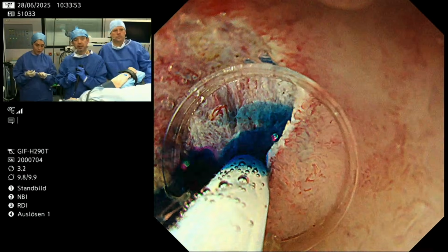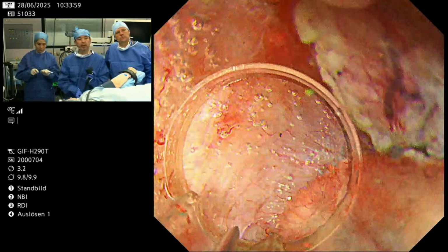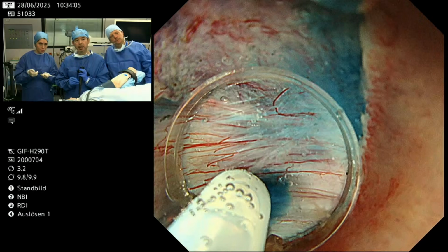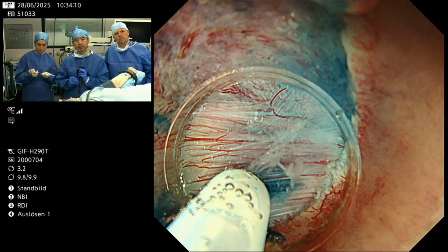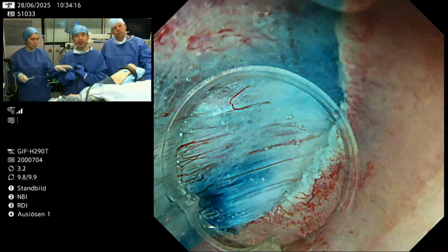So now, how do you differentiate fibrosis and thin muscle layer or muscle retraction in the duodenum? Usually, muscle retraction looks brownish, and severe fibrosis looks whitish or silver color. Okay, that's good enough. Needle in.